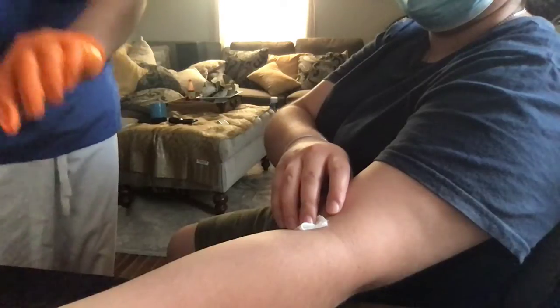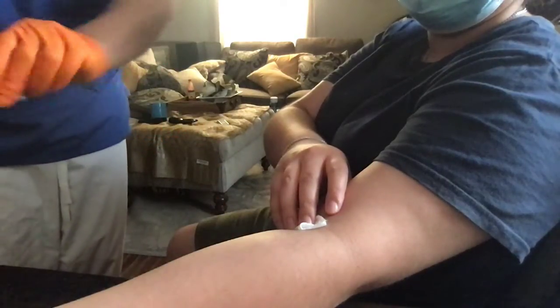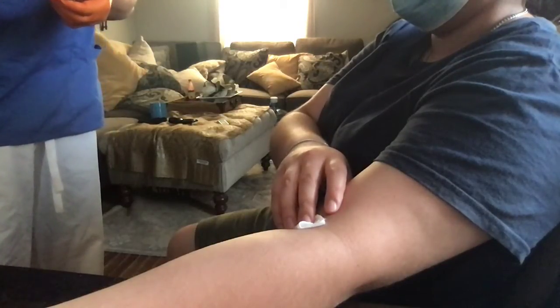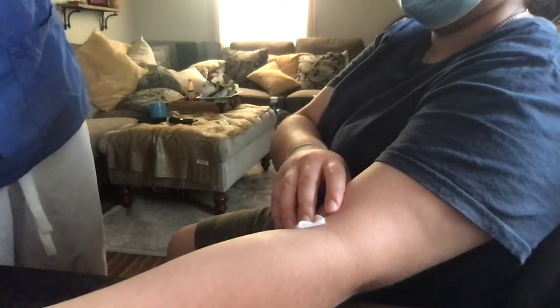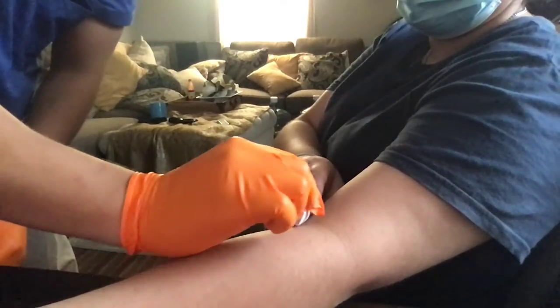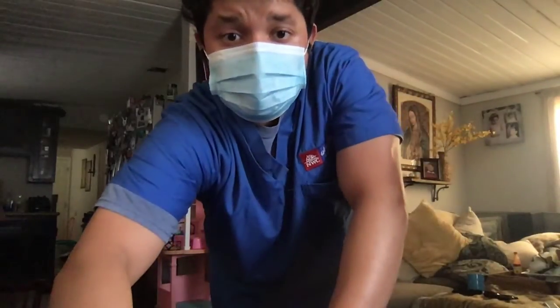Invert each tube eight times. Once done, label each one with the patient's name, date of birth, time, and date collected. Place them in the biohazard bag. Check if the patient has any excess bleeding — she has a little bit, so I apply a band-aid. Afterwards, transport the bag to the lab. And that is how you perform a venipuncture on a patient. Thank you.